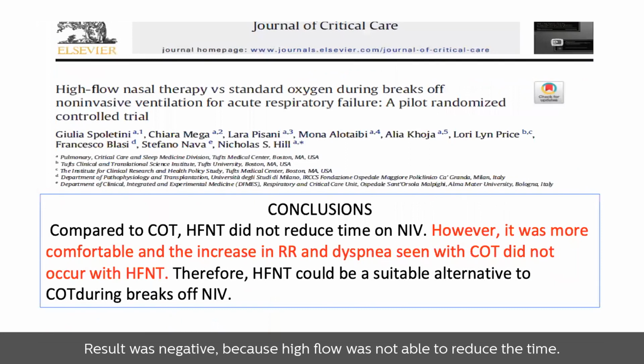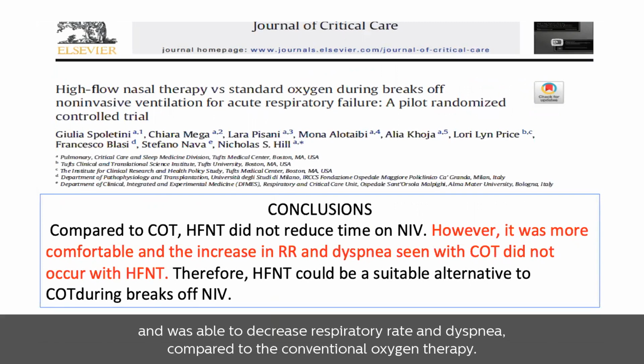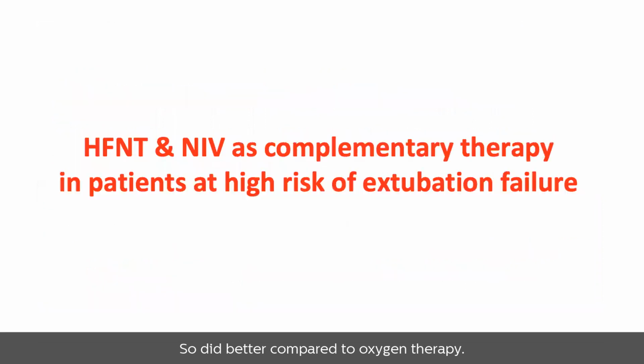The result was negative because high flow was not able to reduce the time, but very interestingly, high flow was more comfortable compared to oxygen therapy, as it was able to decrease respiratory rate and dyspnea. So it did better compared to conventional oxygen therapy.